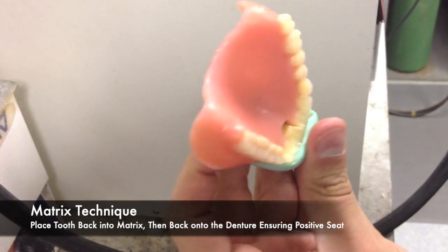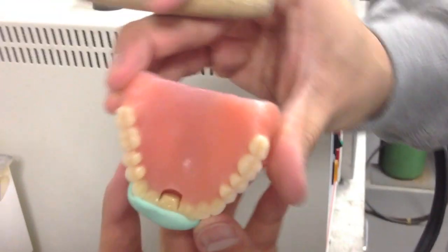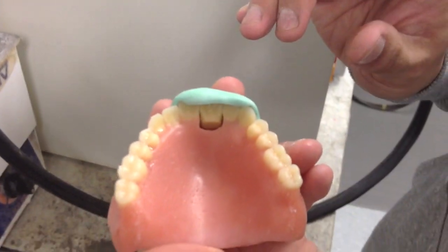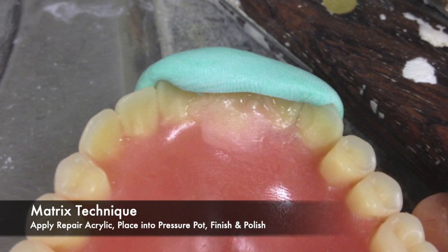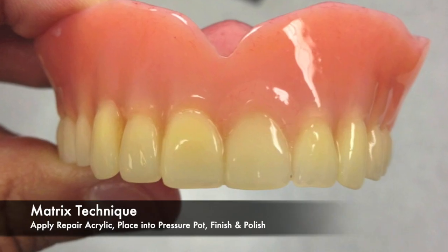If the denture tooth is loose in the matrix, you may want to add a drop of glue to the lingual of the tooth to secure it to the matrix. Once the tooth is secure, you can then add your acrylic to the space, place it into a pressure pot, and then finish and polish as you would any complete denture. These are the results.